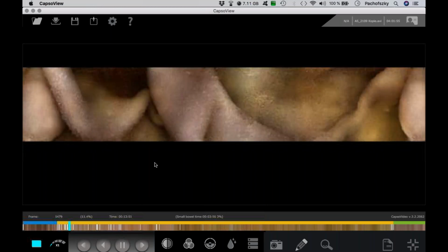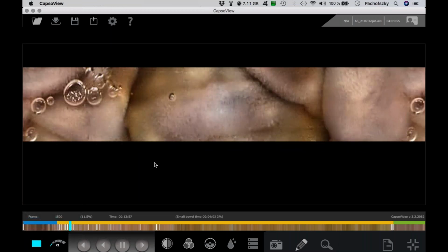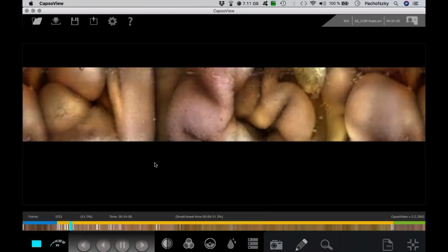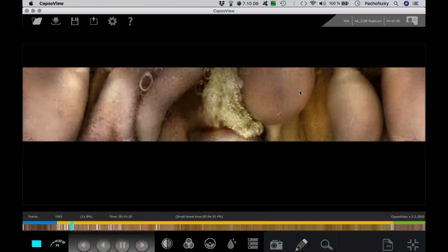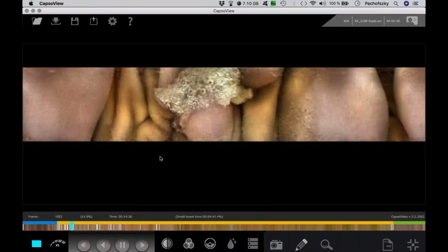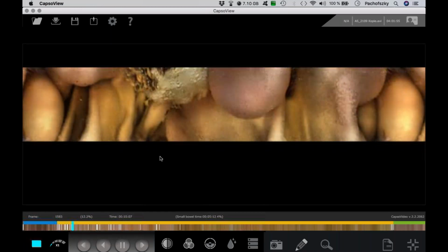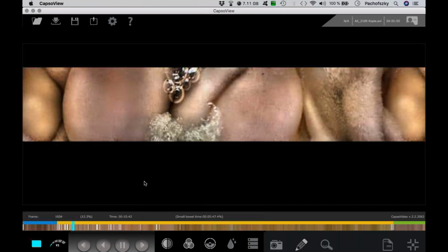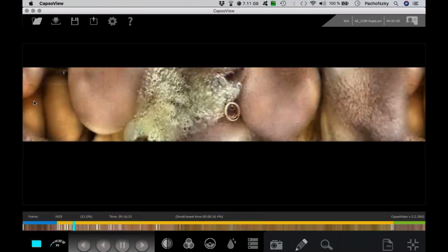So in the next step we did the capsule endoscopy, and we found, distal to the area we can reach with upper GI endoscopy, all of those lipomas. So we're going down here, but then we will find another process. All of them are the same.